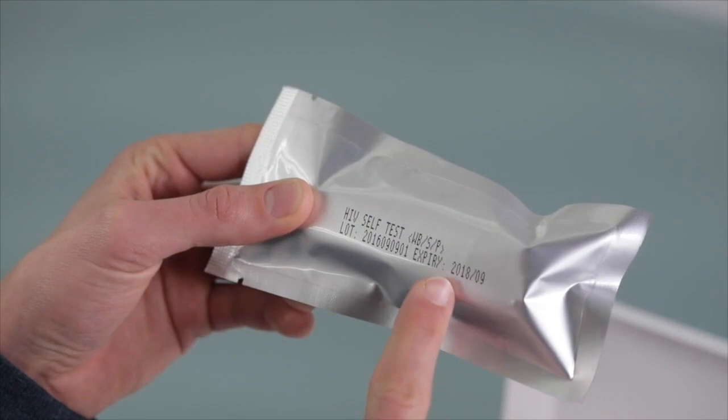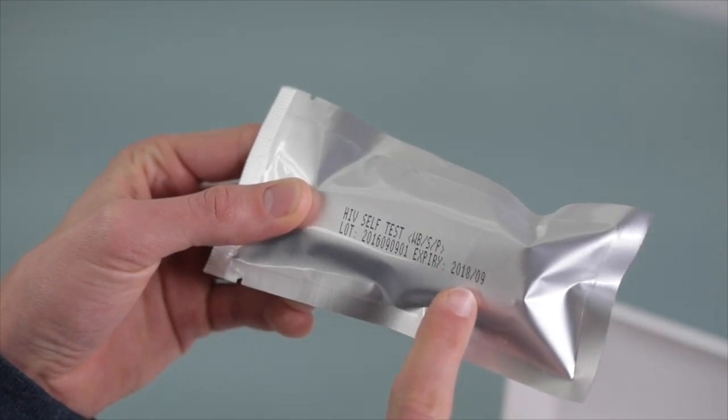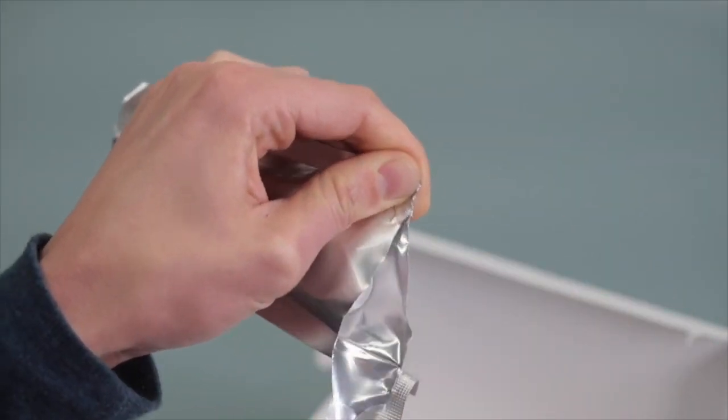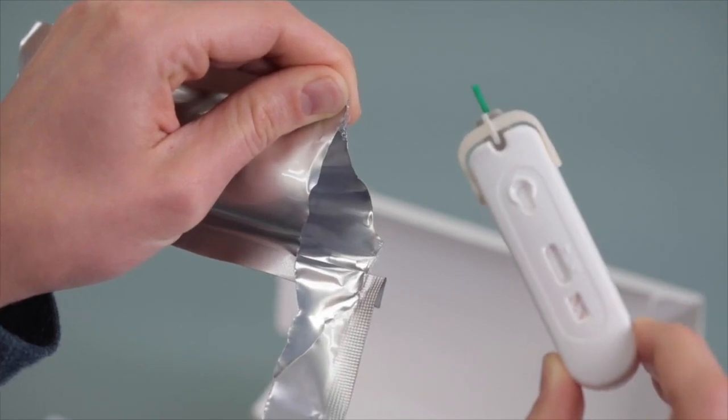Before you open the foil pouch, check the expiry date. Do not use if it is beyond the date stated. Open the foil pouch using the tear notch and take out the test. Do not use the test if the foil pouch is damaged.